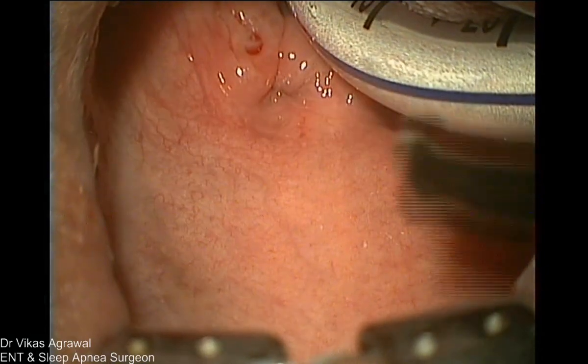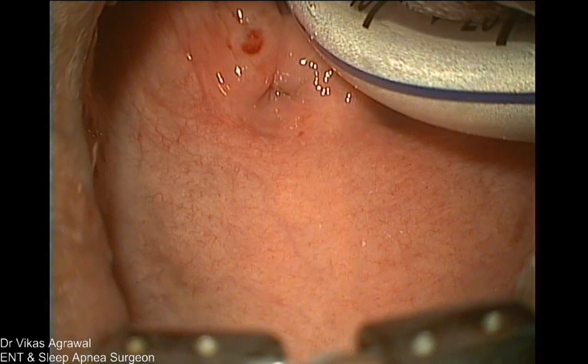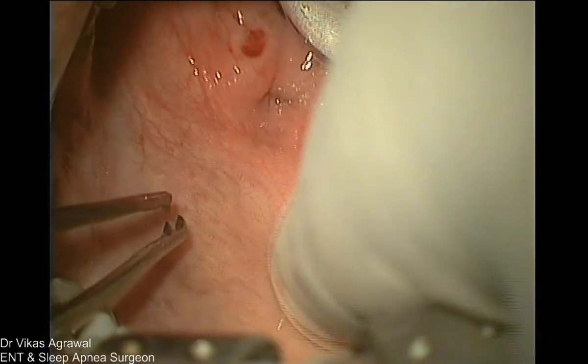Now, second question: is there any special endotracheal tube which you use for intubation, and how do you proceed with it? You can see it's a regular endotracheal tube, and you have seen the intubation happening live.